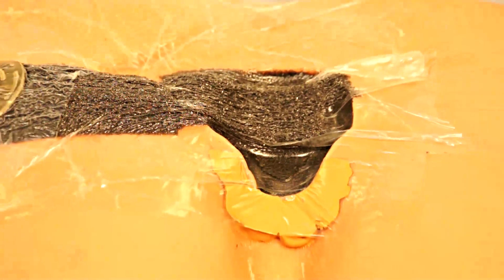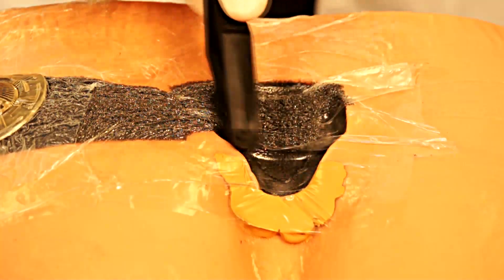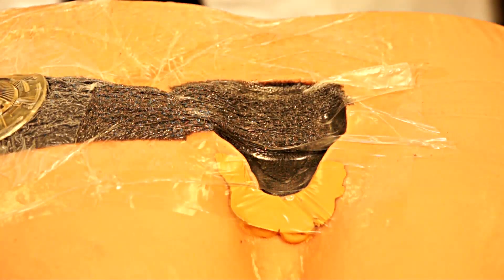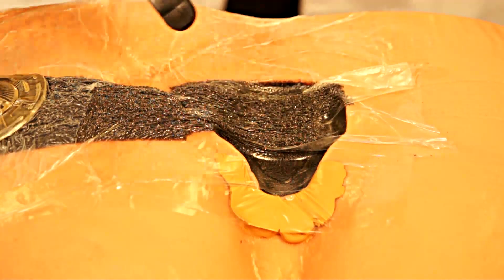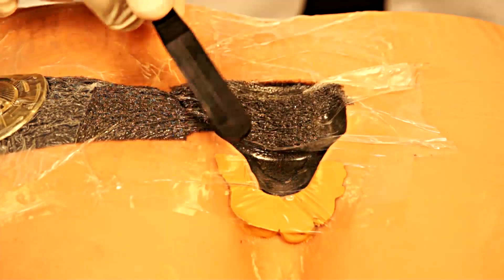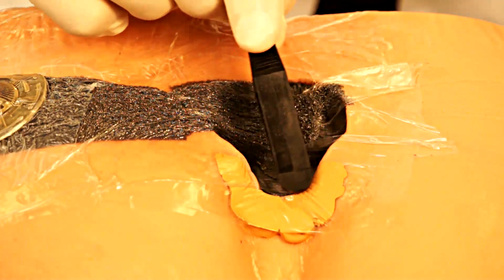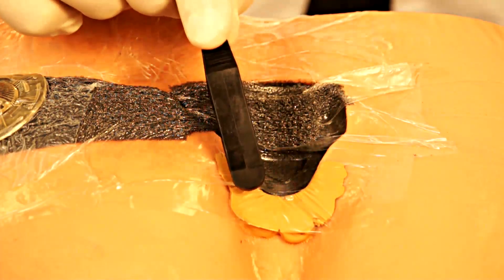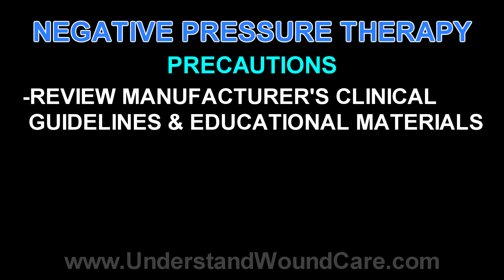One indication that layering might be appropriate is if you have connected your dressing to the negative pressure source and you have a very concave appearance — that would be a reason to consider two layers of sponge. As in the previous demonstration, it is important to protect normal skin from coverage by the sponge dressing and to achieve a seal around the entire wound. You can see that the stoma paste has allowed us to produce an excellent seal at the inferior aspect of the wound, where often times due to patient movement or anatomy an adequate seal cannot be achieved.